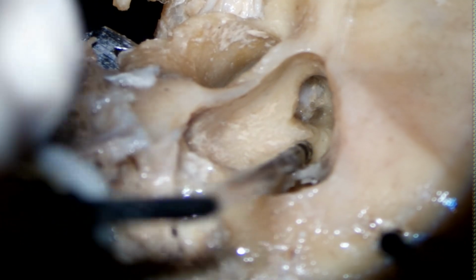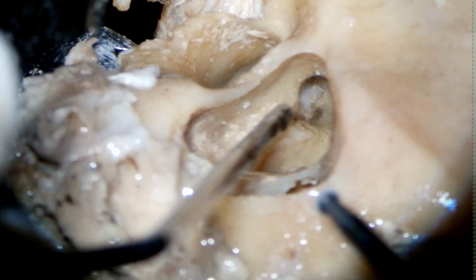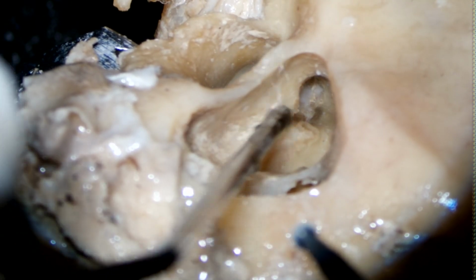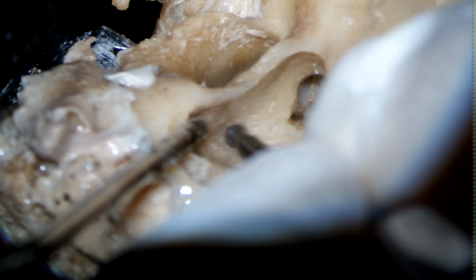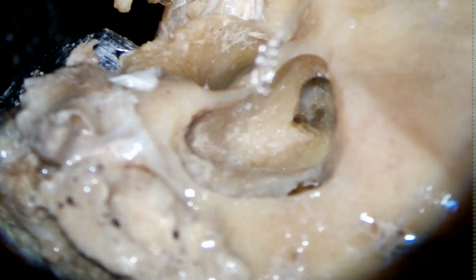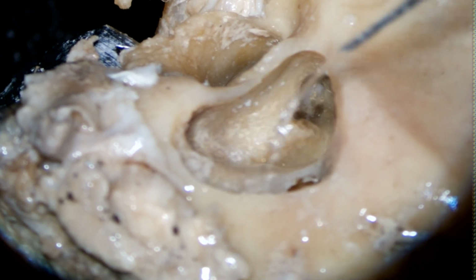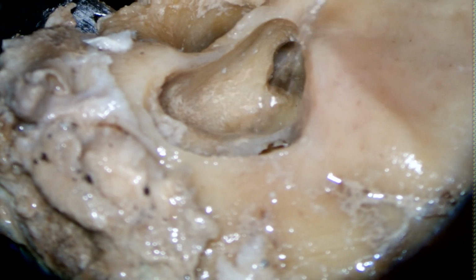This is the semicircular bulge, sir. So now this thin bone actually, and you can see the chorda tympani also. Let me see if... it is not in focus. This okay?